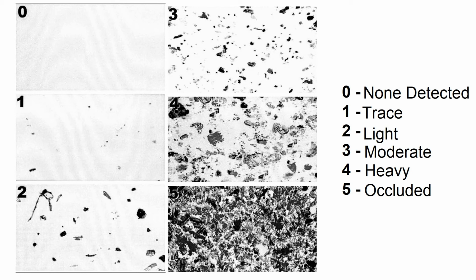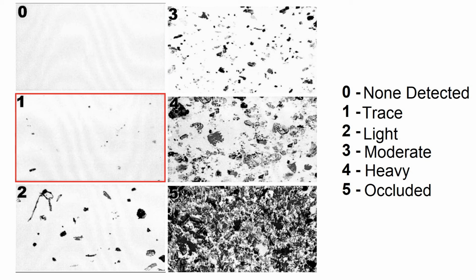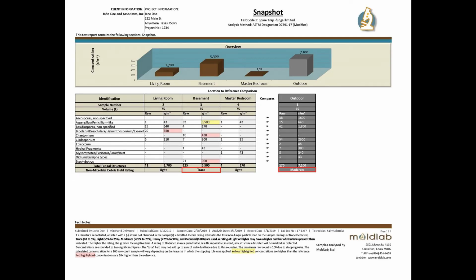Additionally, mold spores may have bounced off of the sample entirely because they impacted onto the debris rather than the adhesive inside the sample. For example, the true amount of mold that passed through a moderate debris field rating sample could be 33% greater than reported. On the other hand, the true amount of mold that passed through a trace debris field rating sample should be no more than 5% higher than reported. Keep this bias in mind when comparing samples with different debris ratings, especially debris ratings that are very far apart from each other, such as trace and heavy.